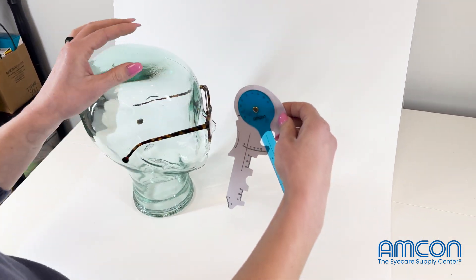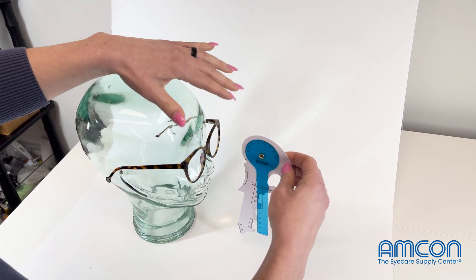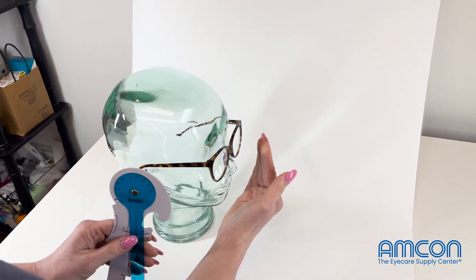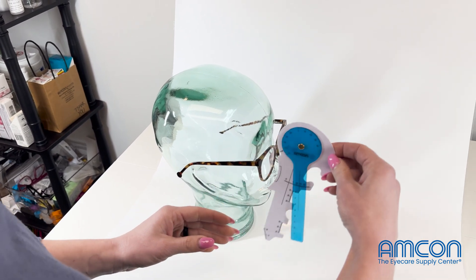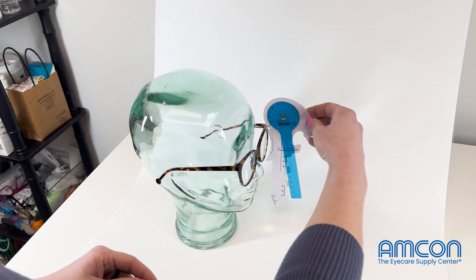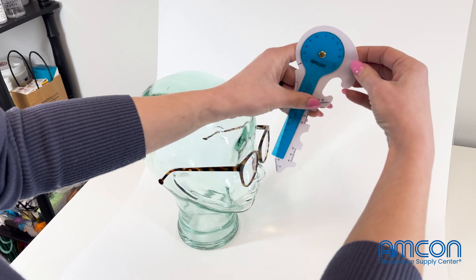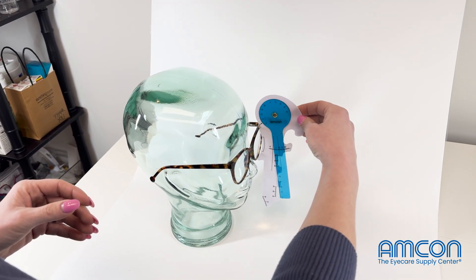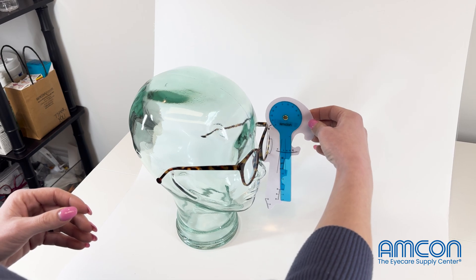Then you're going to measure pantoscopic tilt, which is the angle that the glasses sit on the patient's face — whether it's pantoscopic tilt or retro. You put that on the surface of the glasses, and the little blue indicator will move back and forth until you get to how that frame sits on the patient's face.